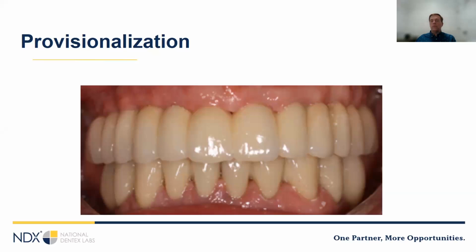If we need to make some significant adjustments, then it may be worthwhile to go ahead and take a study model, and we need to figure out a way to mount it. Just because if the bite was way off, then something might have been wrong with our pre-op materials. And last but not least, you want to use your good judgment on the day of surgery on the occlusion, especially with a lot of these cases where we're, let's say, correcting an occlusal deficiency.